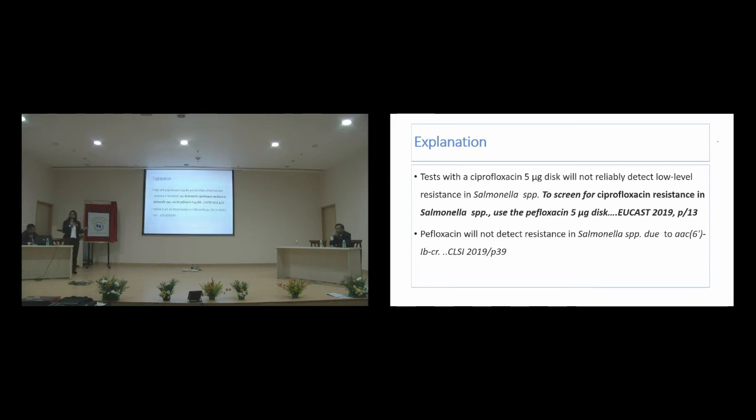Okay, so this ciprofloxacin 5 microgram, how many of you use ciprofloxacin disc? Pefloxacin, any of you are using? No, sir is using. You use, sir?